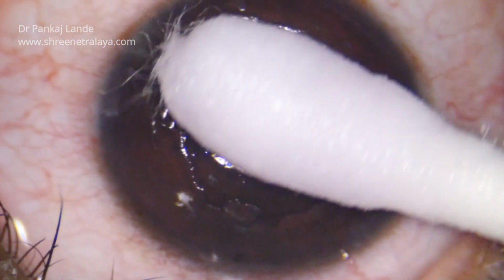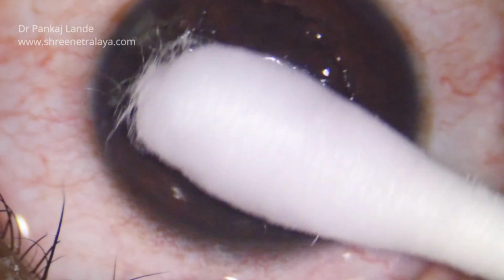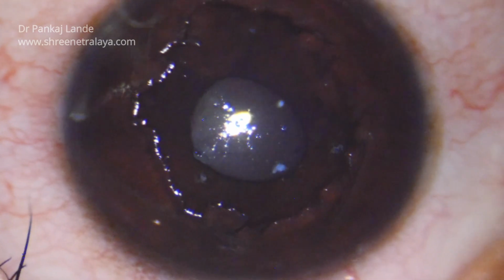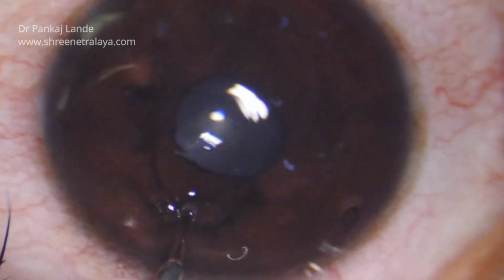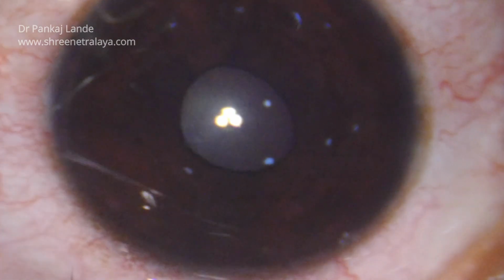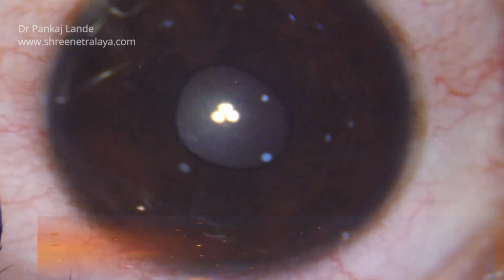In this case, patient's vision improved to 6/6 partial with 0.75 cylinder in the post-op period. So, whenever you are seeing a scar which is anteriorly located in your clinic, get OCT done and get it removed.